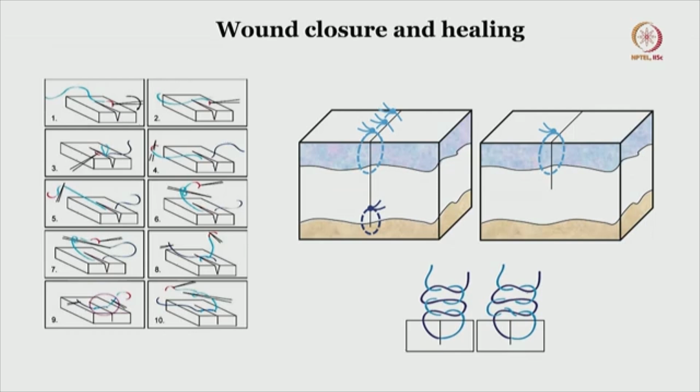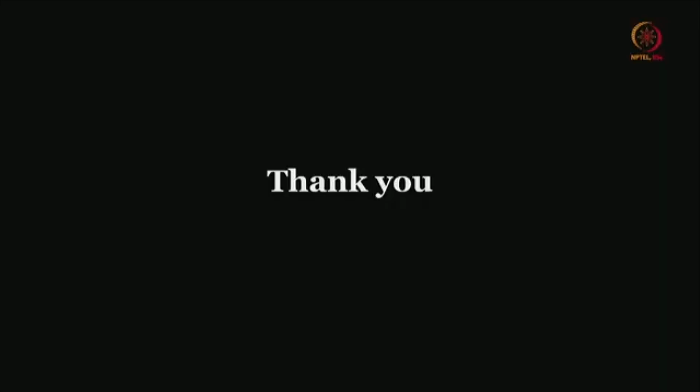Alright. So this again requires practice to master wound closure, and generally if you use post-operative antibiotics and good post-operative care, the wound healing is pretty good. So far I have not seen any gross infection of the wound or gross wound gaping after the surgeries. The scalp layer is very rich in blood supply, so the healing is pretty good. So you can handle it with simple sutures. If it is really a big hassle, surgical staples can be used, which clip the 2 edges by delivering a clip. So that is the end of today's session.